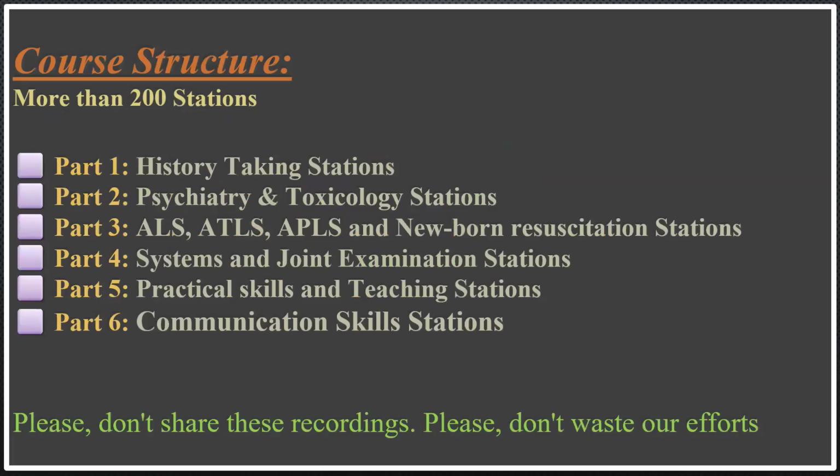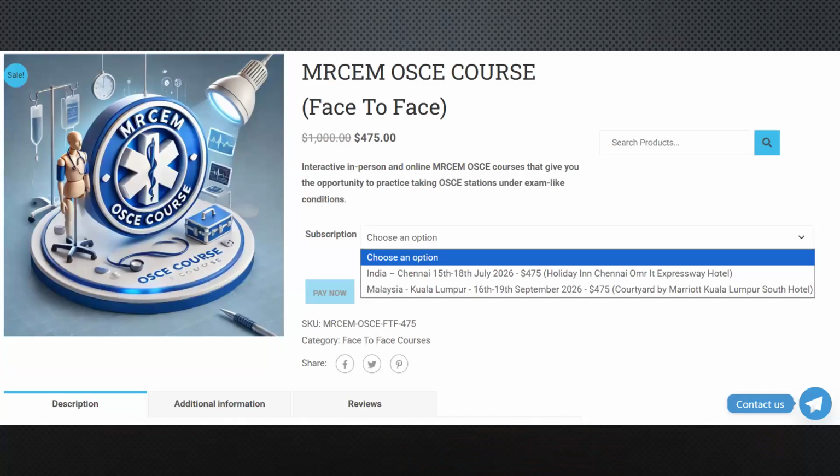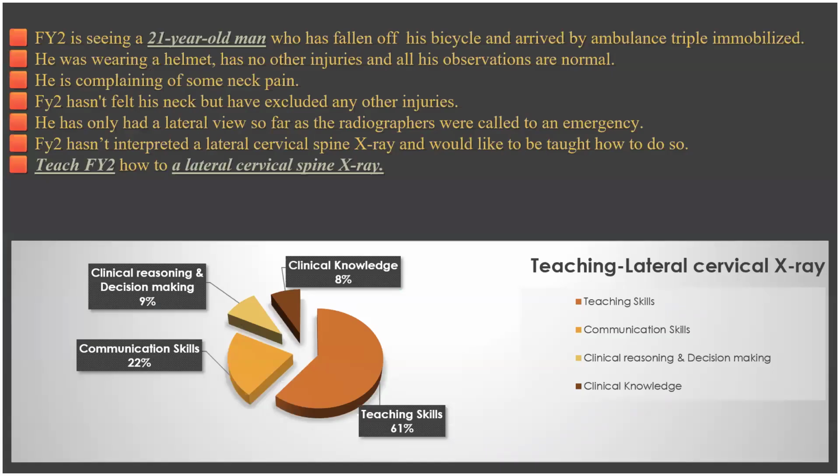So the first station will be cervical X-ray, lateral. Okay. Abbas, please, if anyone interested to practice, you can raise your hand. Yes, sir. Okay. I'm not sure if your signal is good or not. Sir, actually, light gone, sir. Electricity problems. Now it is clear, sir.